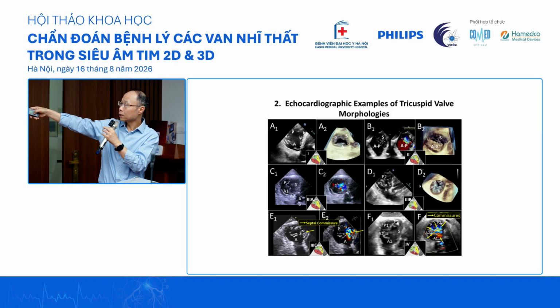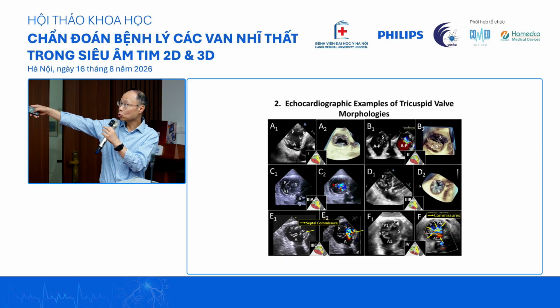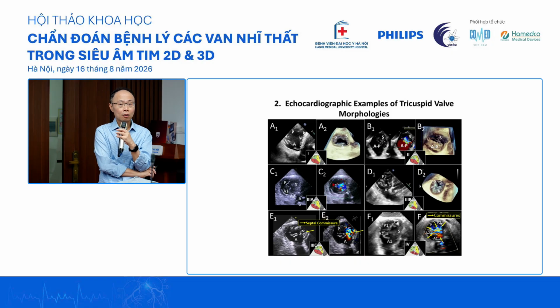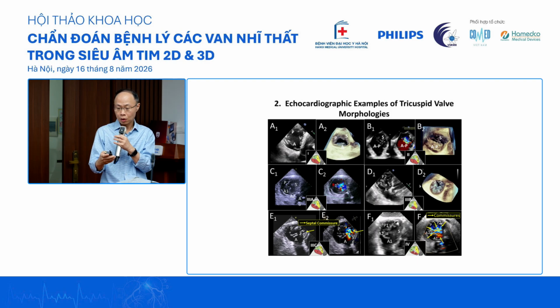So this is somewhat where you can see that there are two septal leaflets, and this thing is almost fused. Sometimes this one can be confused as a bicuspid tricuspid valve, but if you pay attention, there are actually two floppy leaflets here flapping away, and so on and so forth. The one that makes no sense to me is F, where you can see that it's just a whole lot of leaflets coming in. This is the type of case where we usually may not want to proceed with the tricuspid clip, because each of the leaflets is just too small and narrow for your clip system to hold on to and clasp.